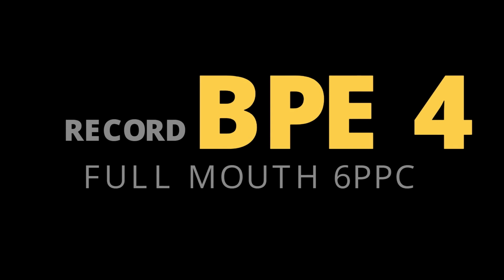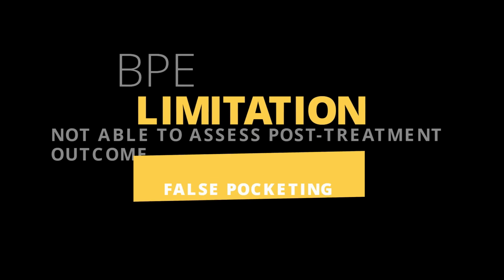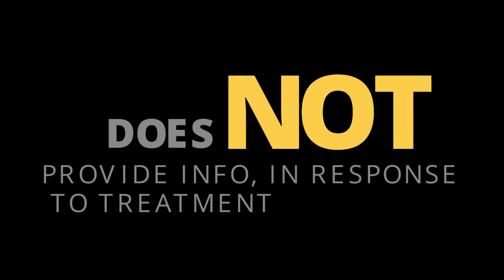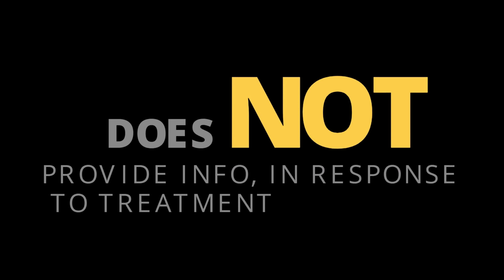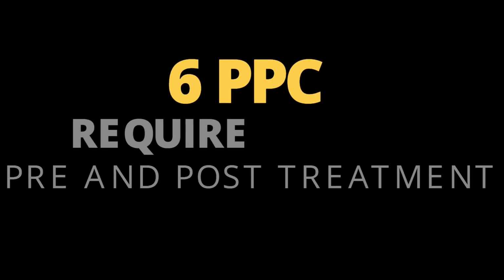There are also many limitations of the BPE, and one of them is that it cannot be used to monitor the response to periodontal therapy, because it does not provide us with information on how sites within a sextant change after treatment. To assess that, we need to be carrying out a 6-point pocket chart before therapy and after treatment to see what the treatment outcomes are. Also, it's important to note that BPE should not be used around implants.